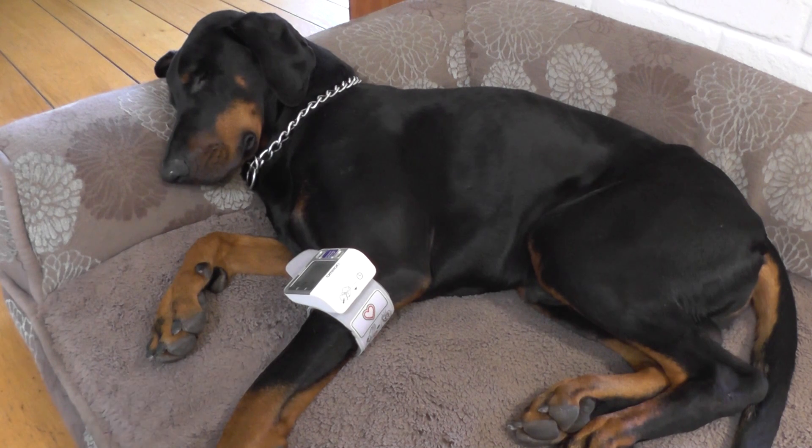So if you have a need to monitor blood pressure at home, it's a lot cheaper to purchase the monitor and do it at home.